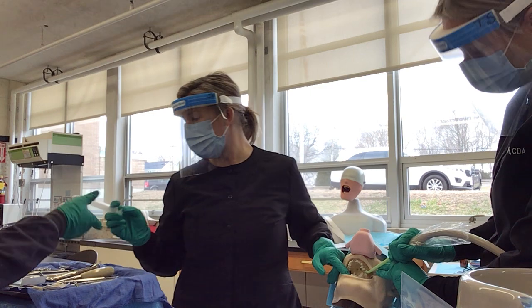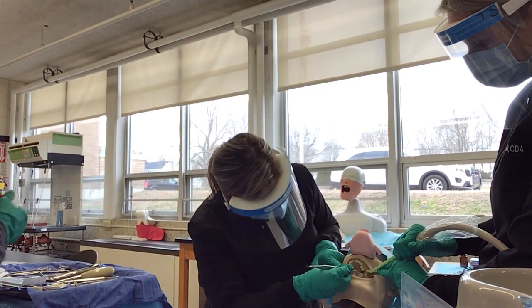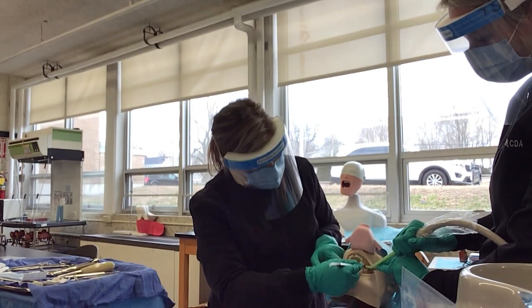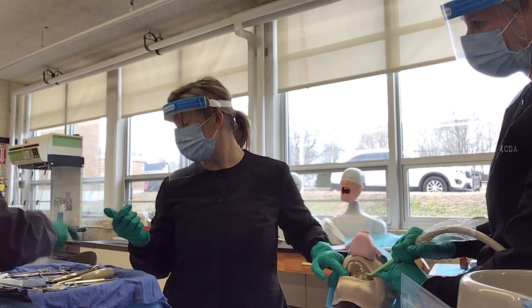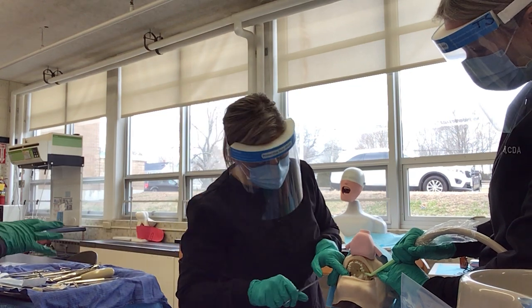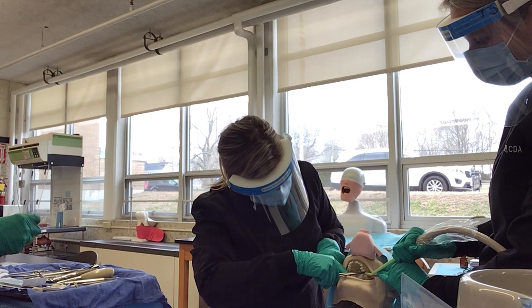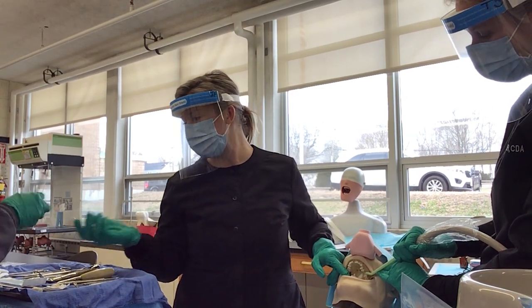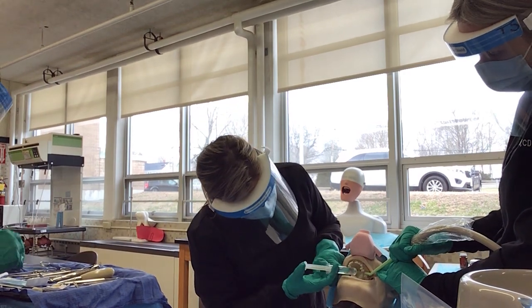And I'm going to ask for the bone file, please. There's a little bit of roughness on that alveolus, so we're going to smooth out that alveolus. And then I need a hemostat, please. Some fragments of tissue we're going to get out of there. And she's going to grab those for me, or I can just send them up to suction. Good, and I'll put the irrigation again, please. So we're going to irrigate, and then we're going to get ready to close.